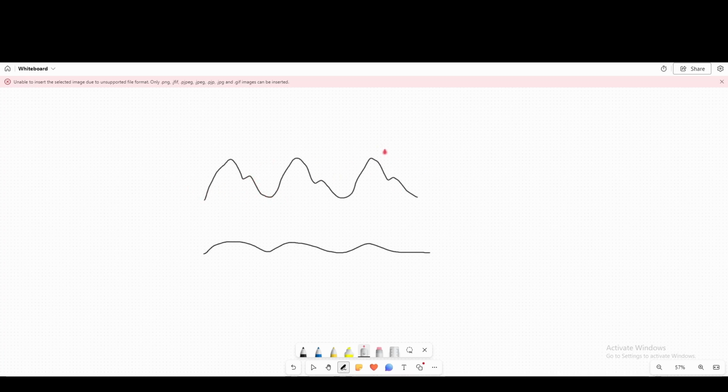None of that is important, right? But what is important is that when these features are large and well defined, this is a more accurate reading, right? This is showing that you have a good perfusion state, right? And then on the other hand, this drawing down here is going to be a poor perfusion state, right? You have a situation where either your limb is not perfusing properly or possibly your pulse oximeter was placed incorrectly. I would say after 1 or 2 adjustments, if your reading isn't looking like this, then yeah, you probably have poor perfusion to that limb, and I would try another limb, right?